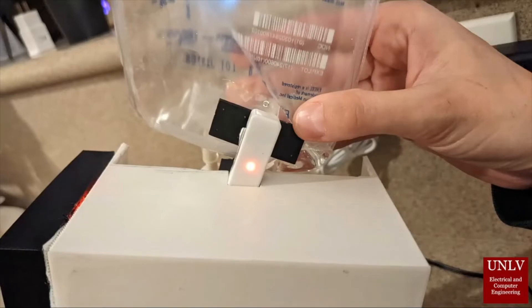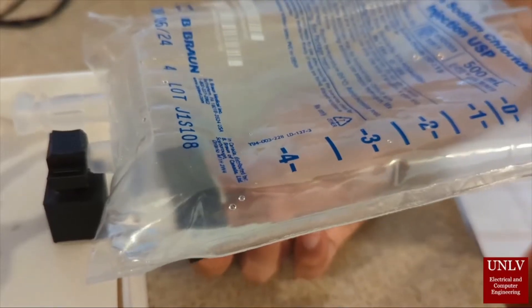This is the liquid level sensor. That little light indicates that it's detecting air and the alarm will go off, and when the light is off it is detecting liquid.